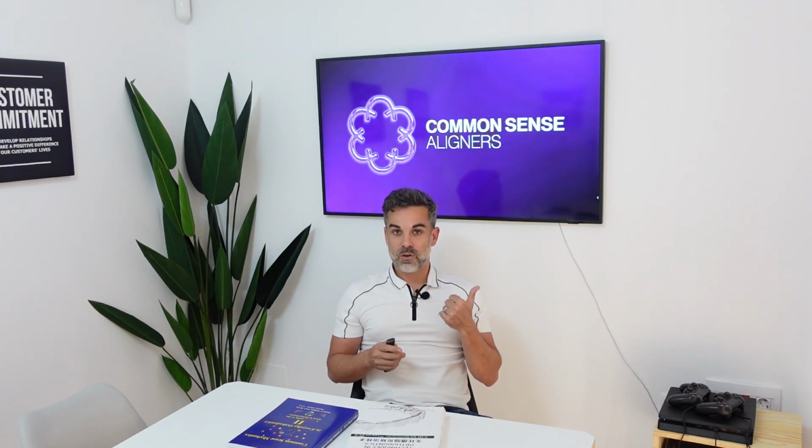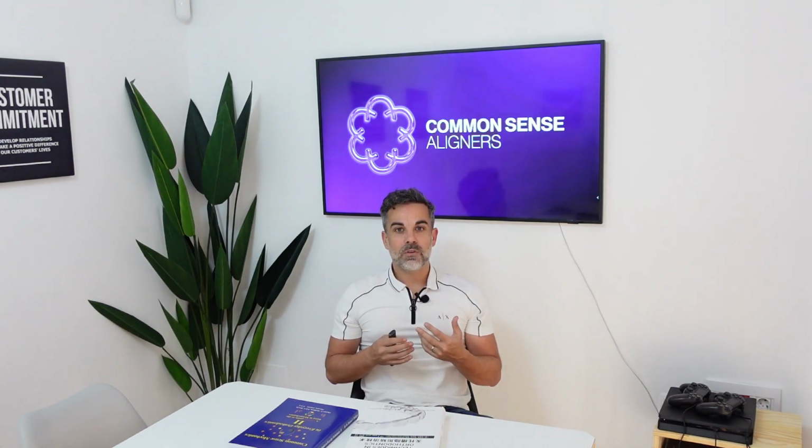So if we talk about scanners, intraoral scanners, let's say we have to think of connectivity, we have to think of resolution, but we also have to think of artificial intelligence, okay? This is quite important. And the integration of new features of the smile or the TMJ. Of the second point we're going to cover today.